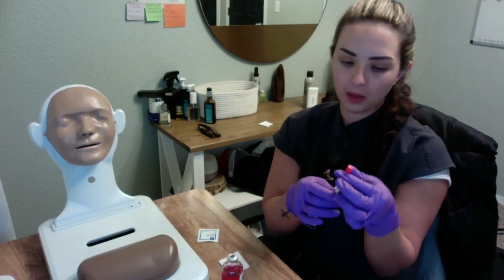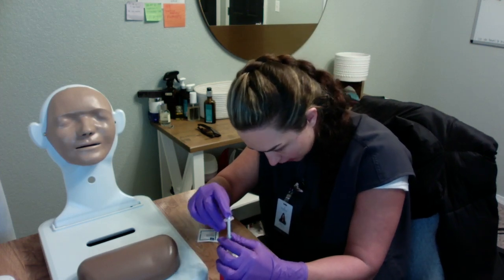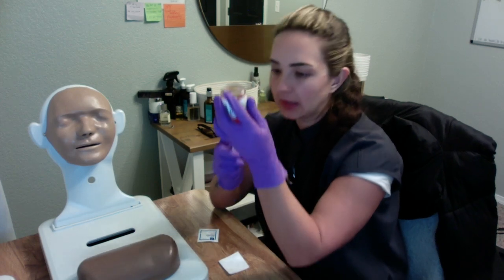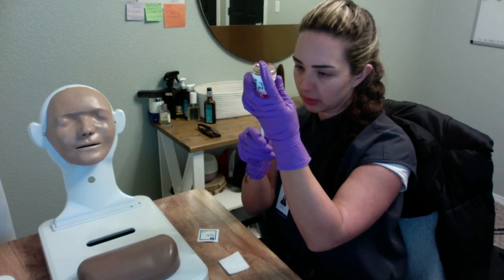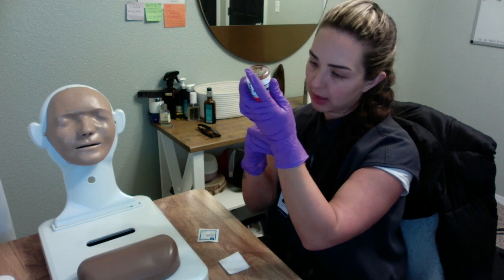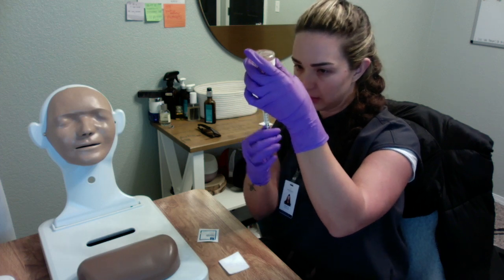Okay. Right. So then we are going to get our medication. We're going to inject the air, and then we're going to invert. And now we're going to check for any air bubbles, and we can tap the syringe and push the plunger back up if we do have air bubbles. So tap and then pushing the plunger back in.